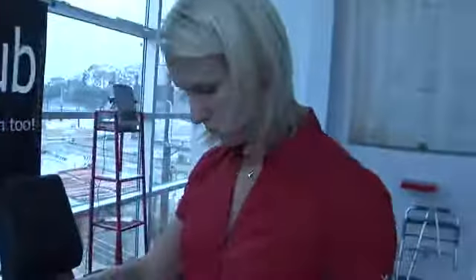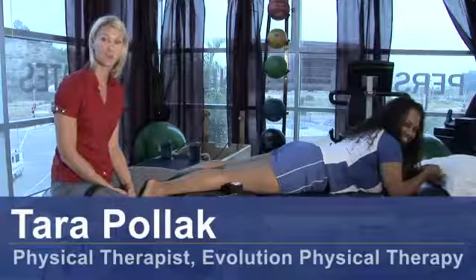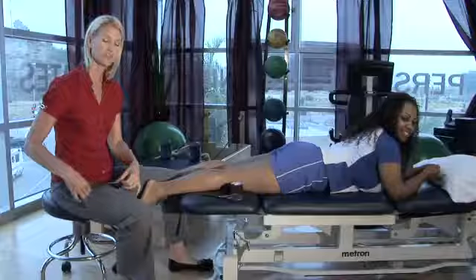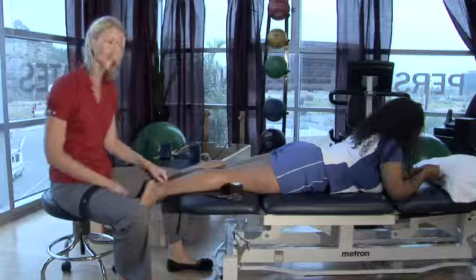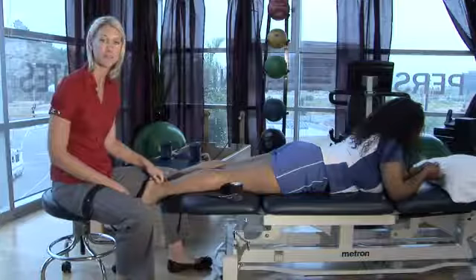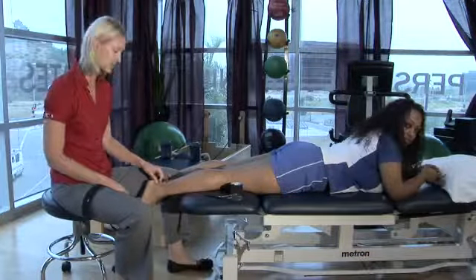Hi, I'm Tara Polak, physical therapist at Evolution Physical Therapy, and I'm here to show you how to tape your Achilles tendon. We often use a tape called Kinesio Tape or Kinesiology Tape to help support the calf and provide relief for any kind of Achilles tendon pain, whether it be Achilles tendonitis or any other kind of overuse injury to the Achilles.